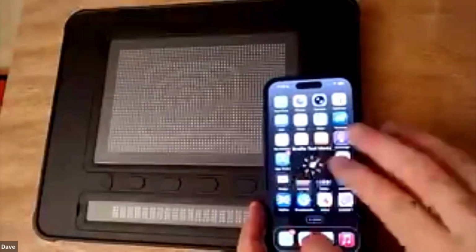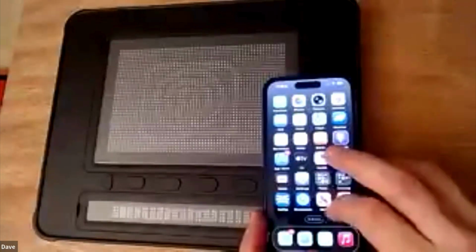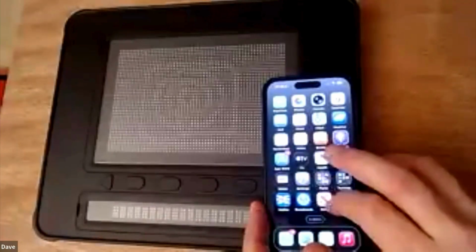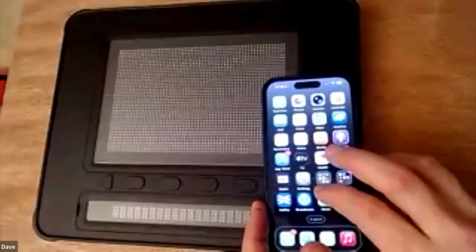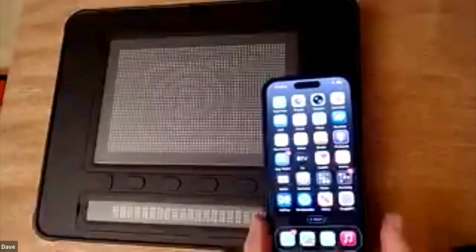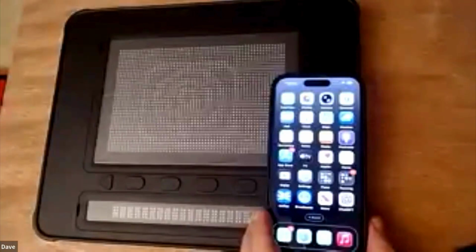Oh, there is another setting. Let me... Braille text mode, reading mode. Here we go. Braille text mode. And there are 4 modes here that VoiceOver have given us. So I'm currently in reading mode. If I flick up... Images. So I can have images only. Preview mode. Reading mode, no images. And reading mode, which is the one that I tend to use, which gives me a little bit of a mix of text and tactile images.